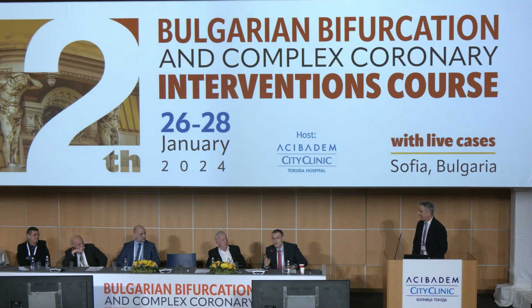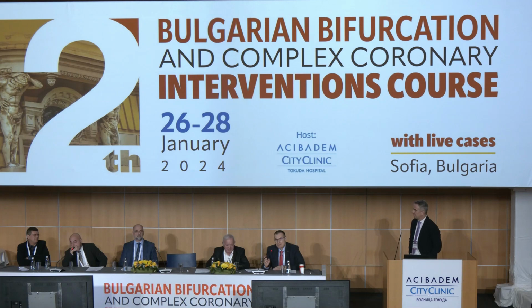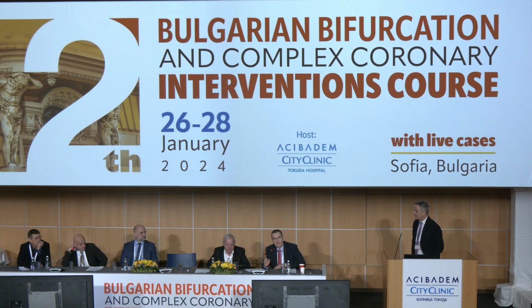We applied now for a grant for the Rampart system, and I hope that we will gain it, and we will have Rampart maybe this year, I don't know. And of course we tried now with the EggNest because they are just being introduced to the Bulgarian market at the moment. And as far as I know, there is one zero gravity system in Alexandrovska, my ex-hospital.